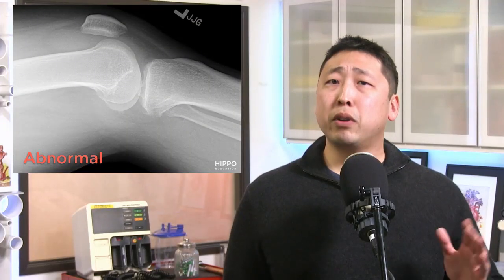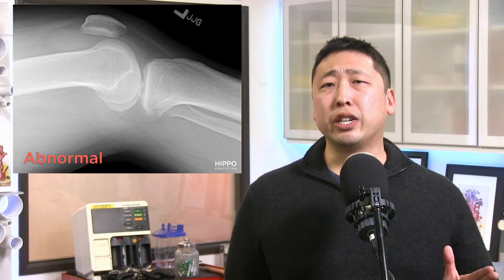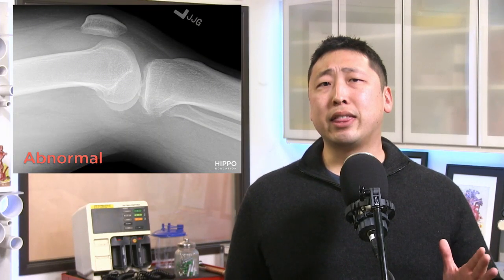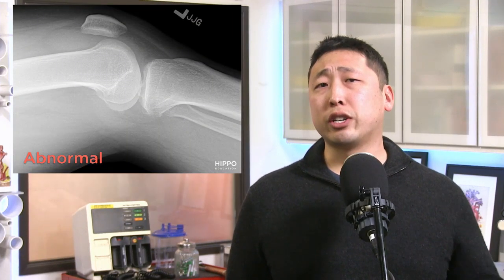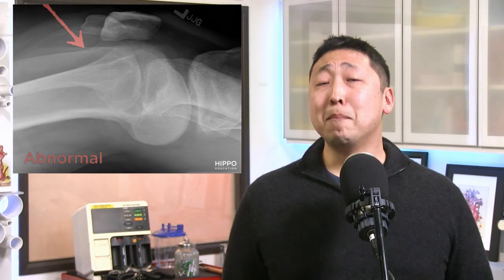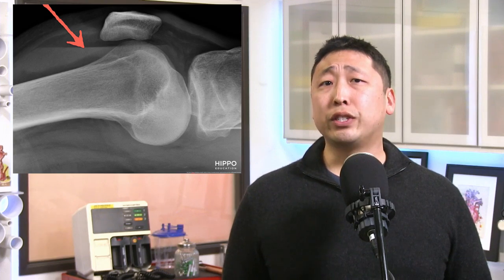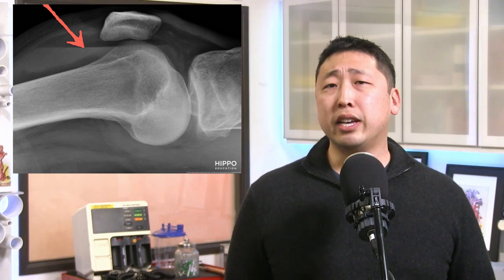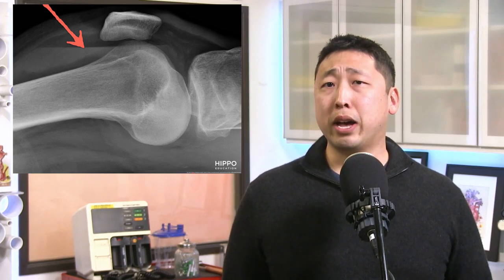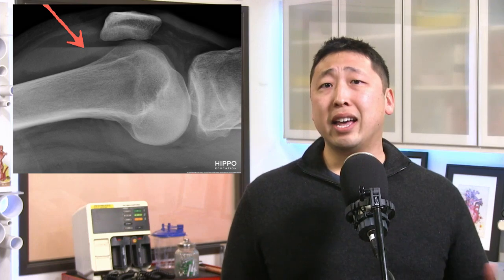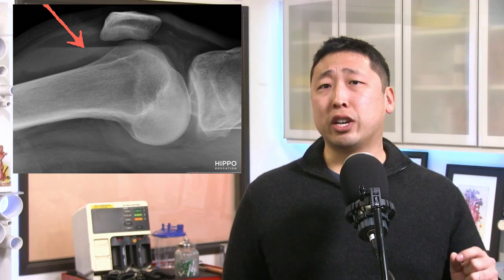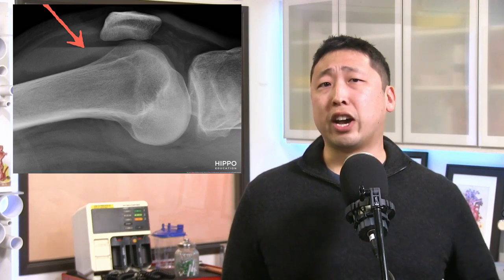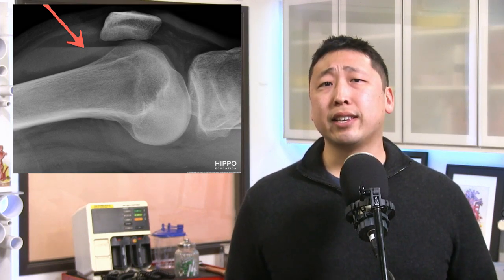Now the presence of a knee effusion does not mean that there is an intra-articular fracture, but if you see lipohemarthrosis in the suprapatellar pouch with fat and fluid layering out, that highly suggests an intra-articular fracture — in this case, a tibial plateau fracture.